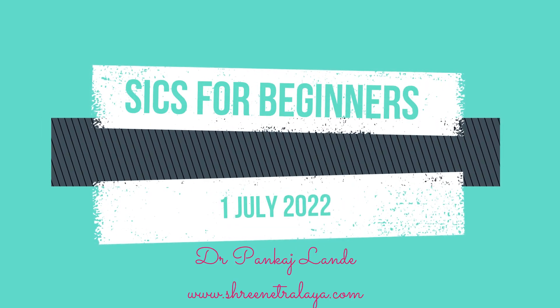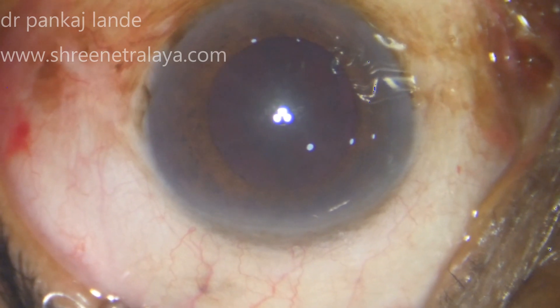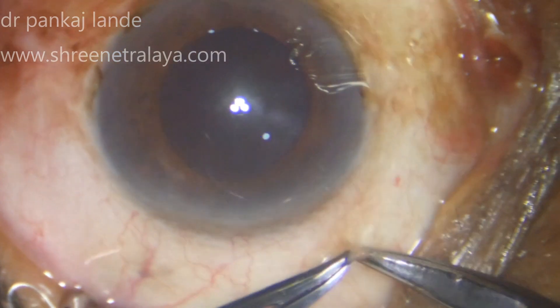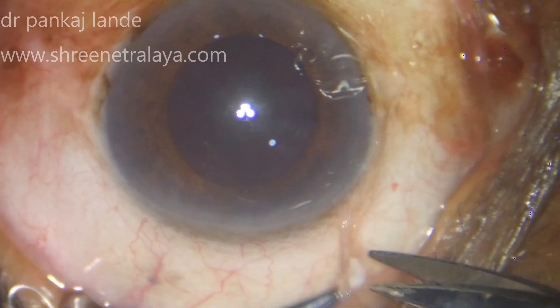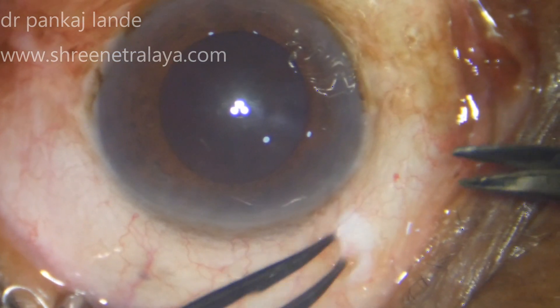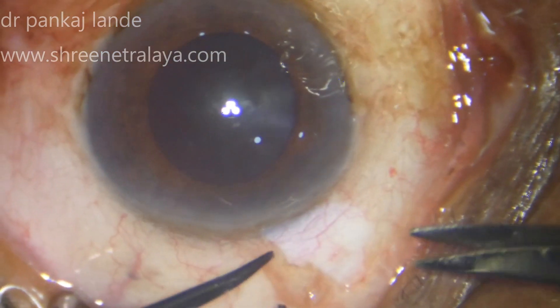In this era of phacoemulsification, the importance of SICS cannot be underestimated. It is one of the safest techniques for complicated cases and for hard cataracts. A surgeon should decide which technique will work best in their hands for the best outcome of the patient.